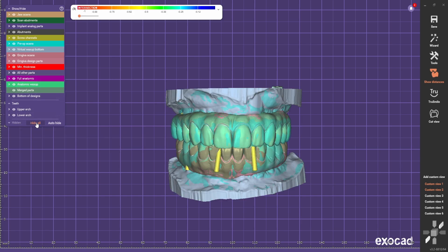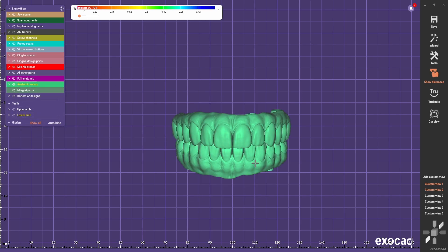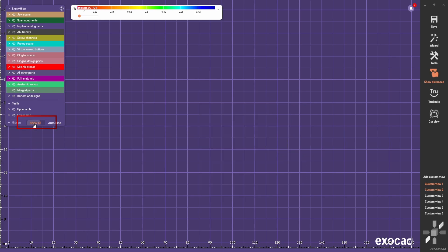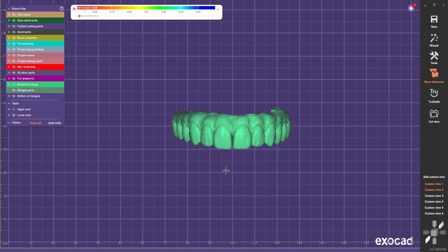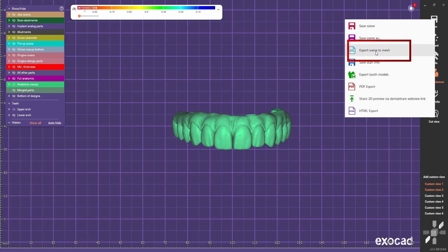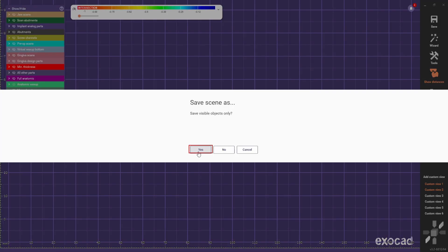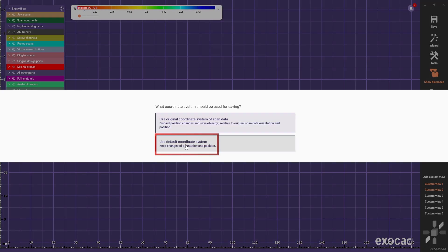First, make sure that the only visible object is the full arch that we want to adapt to the bar. Go to show all, then click hide all, and bring up only the file that you want to export and hide everything else. Right-click, save and export scene to mesh. Call it 'full contour' because this is the design we are going to adapt to the bar, and save. Save visible objects only — yes — and use default coordinate system.